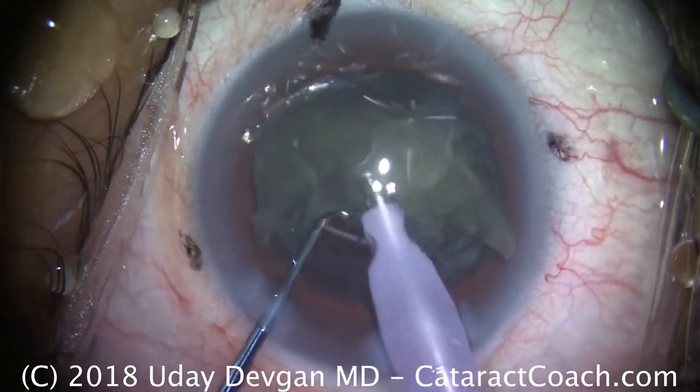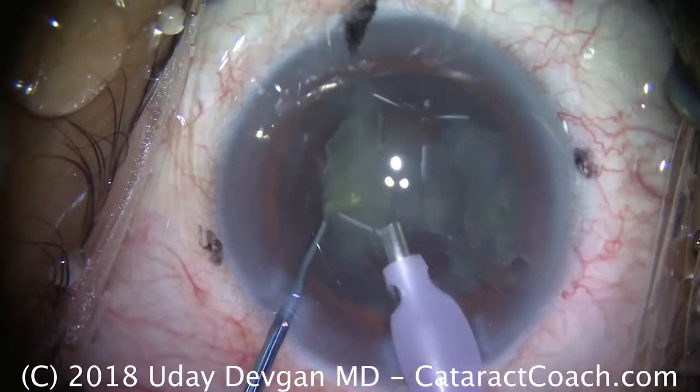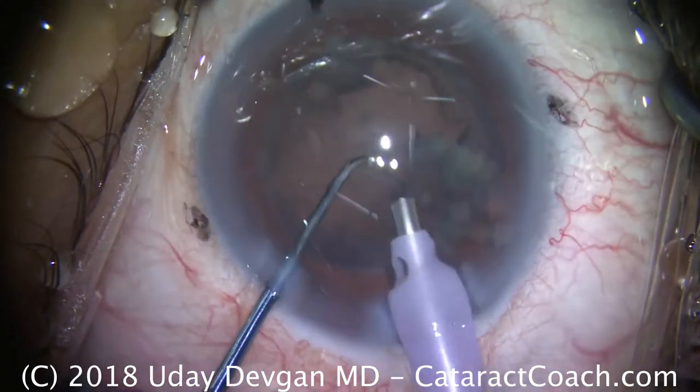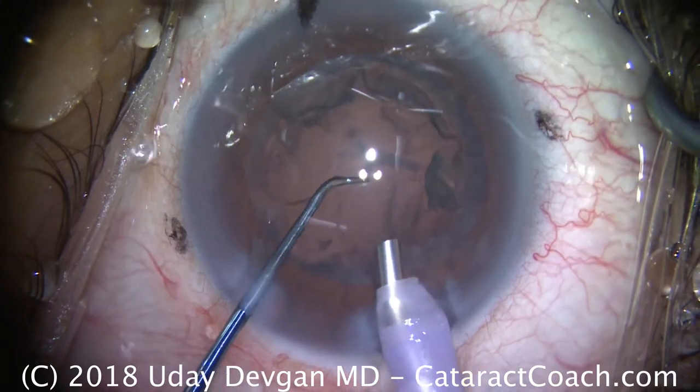Very little ultrasonic energy is needed in this case, and this patient should have a nice clear cornea on post-op day one. The chopper is being put in a safe position to protect from fluidic imbalances and to make sure the posterior capsule stays away. Looks great.